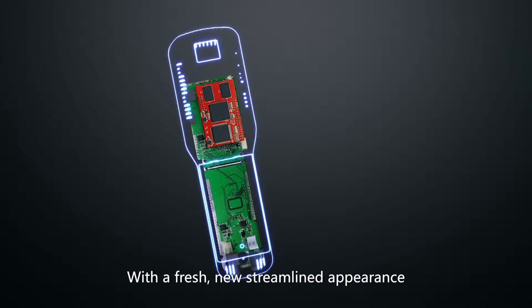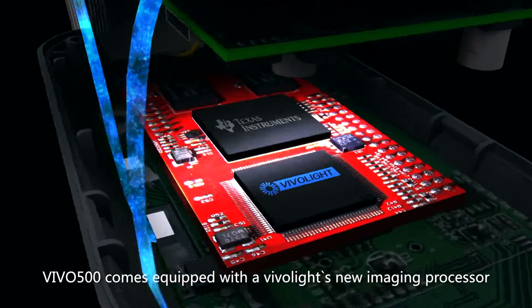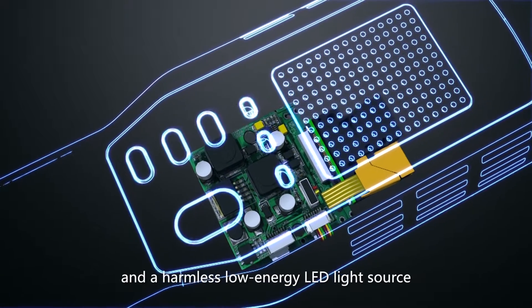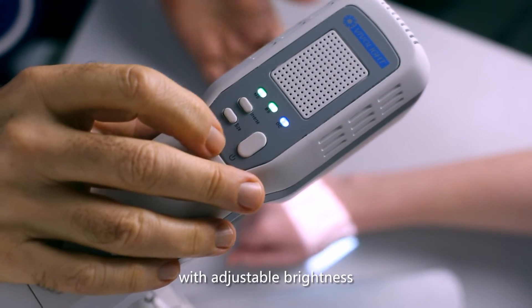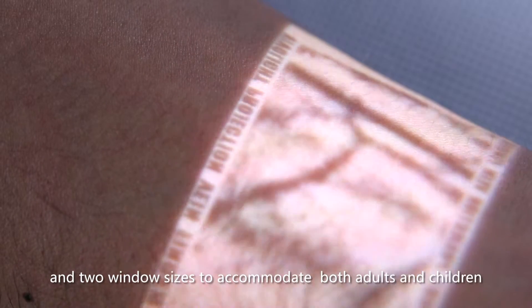With a fresh new streamlined appearance, VIVO 500 comes equipped with a Vivolight's new imaging processor, a pico projector optical module, and harmless low-energy LED light source. VIVO 500 is easy to operate, with adjustable brightness and two window sizes to accommodate both adults and children.